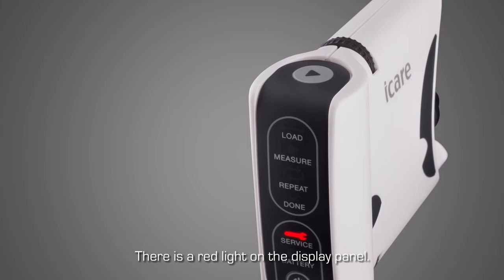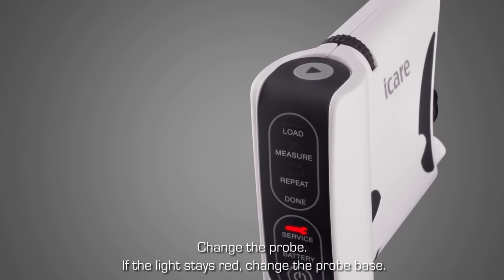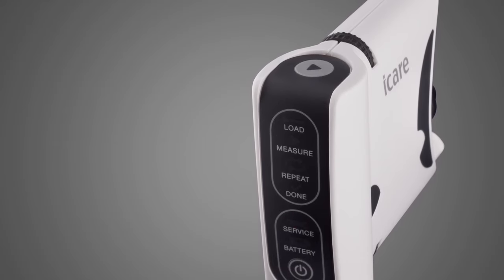If there is a red indicator light in the display panel, replace the probe. If the light is still red, change the probe base. Start the measurement again.